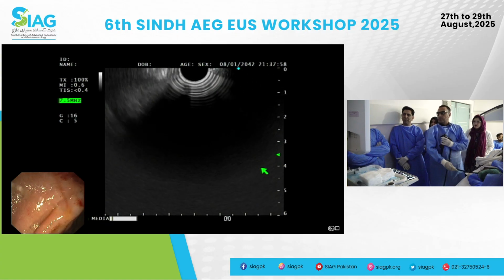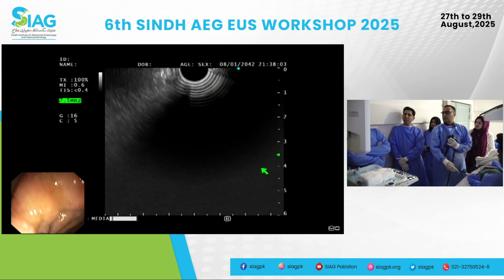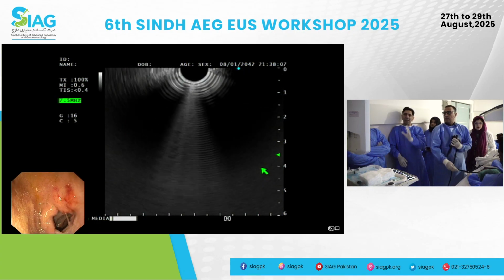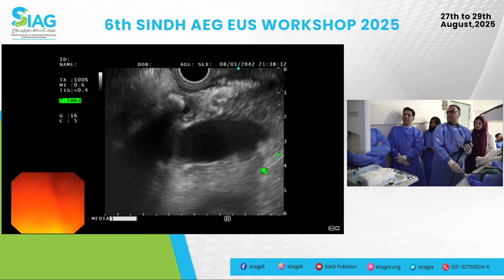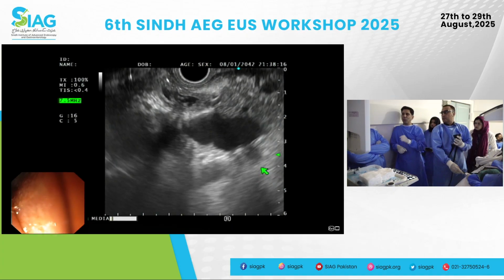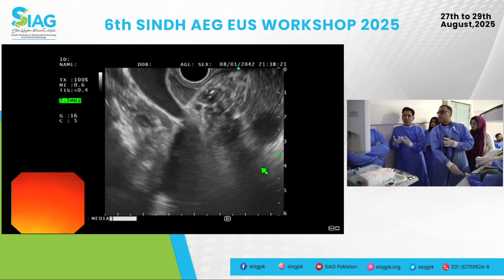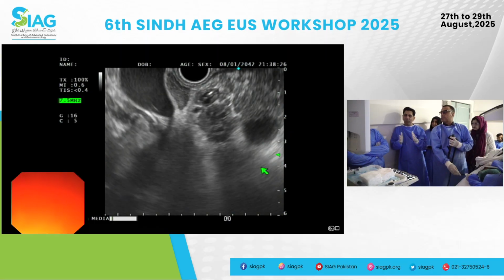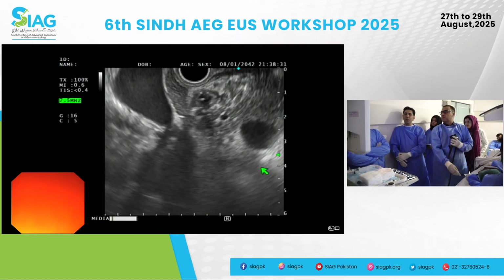Coupling, coupling, coupling. Again, another important message for the delegates: ERCP is all about position, position, position, and EUS is all about coupling, coupling, coupling. So you need to maintain coupling. Another very important takeaway message from these last two to three days is to try not to look at the endoscopic views. I know as endoscopists we have this inherent urge to look at the endoscopic images, but for EUS you actually have to go colorblind and entirely focus on the EUS images unless and until you actually have to.